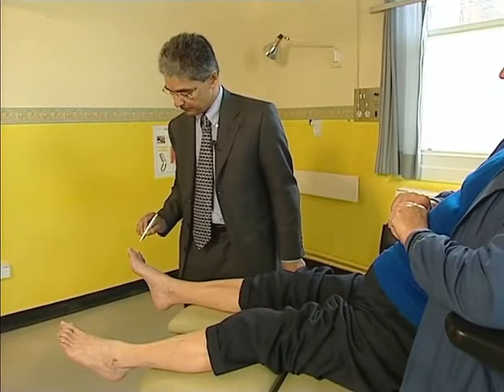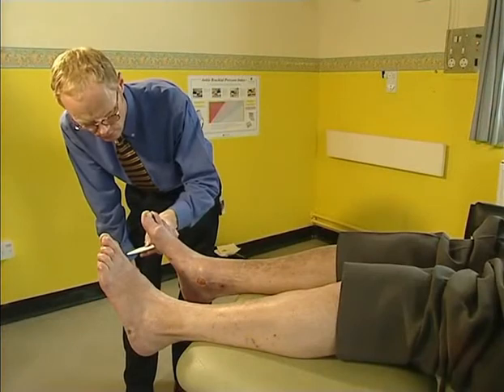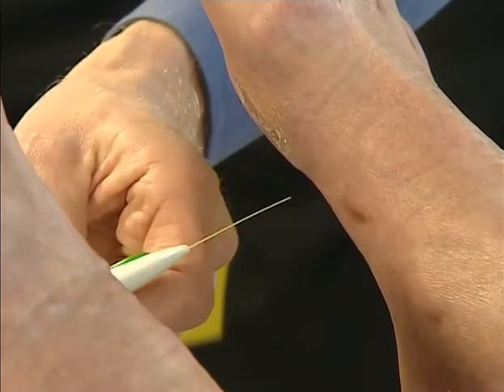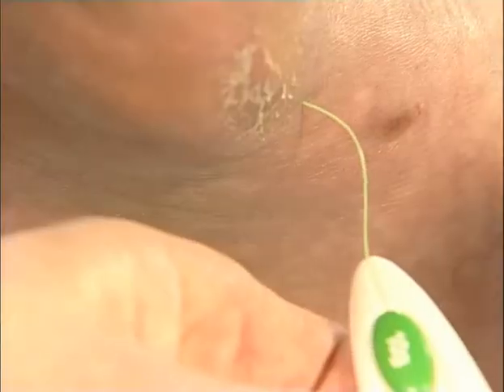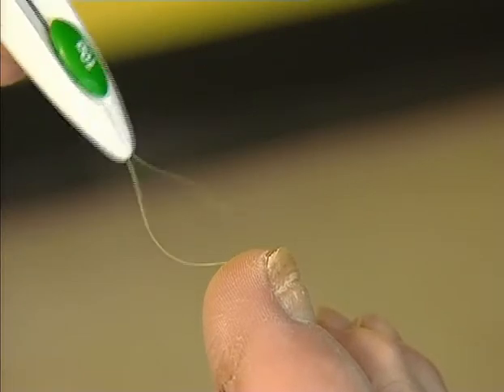We strongly recommend the use of the 10-gram nylon monofilament as it's the most objective, reliable and reproducible tool for testing light touch. The monofilament is placed at 90 degrees to the skin surface, pressed gently until the filament buckles, held in this position for 2 seconds, and then removed. Do not let the monofilament wriggle.